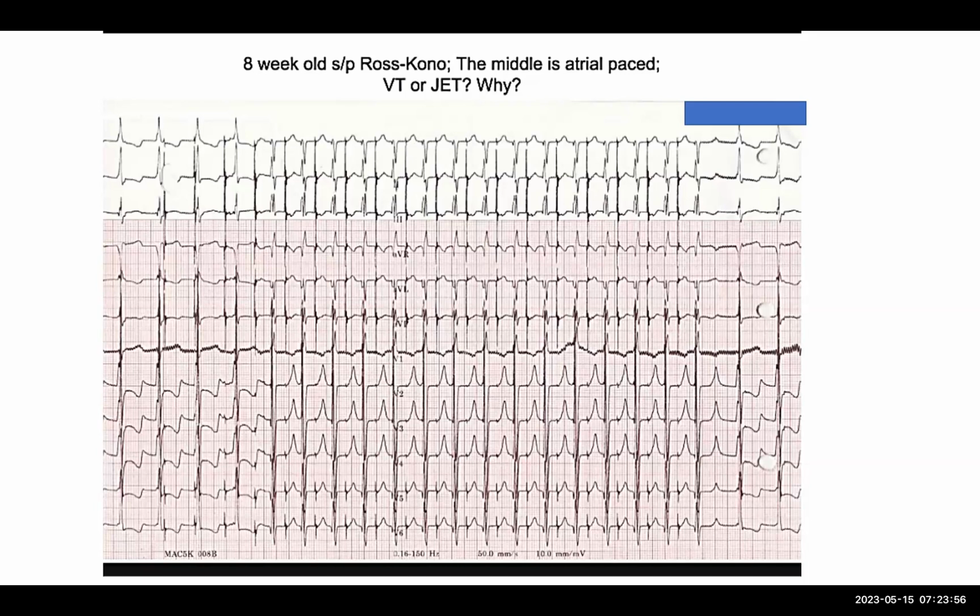What if I told you that the hospital just ran out of all antiarrhythmic therapy? There are no antiarrhythmic medicines. Is there anything else based on this tracing that you could do? Well, it looks like we can also pace the patient. Right. If you pace the patient, we're demonstrating that we can suppress it. So if you had said to me that you would like to not treat it, but instead pace and just suppress it, that would not be an unreasonable approach.